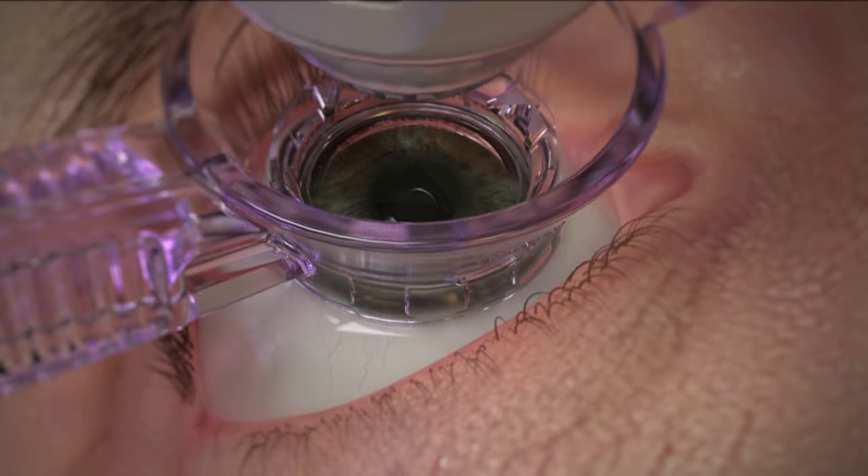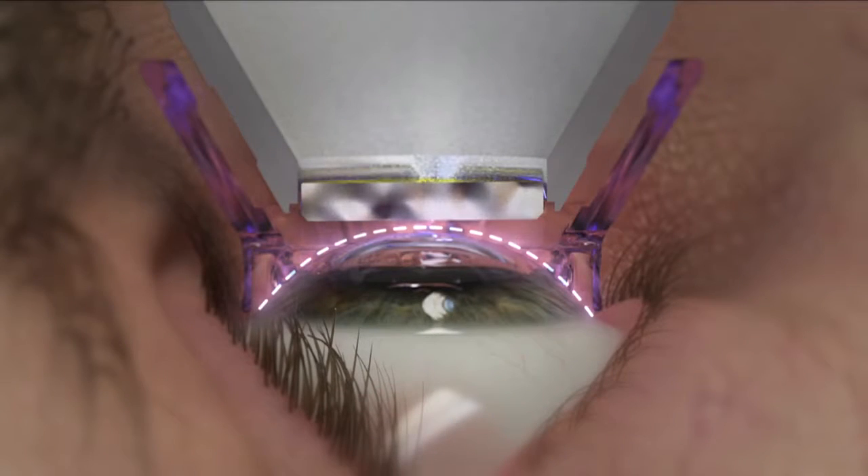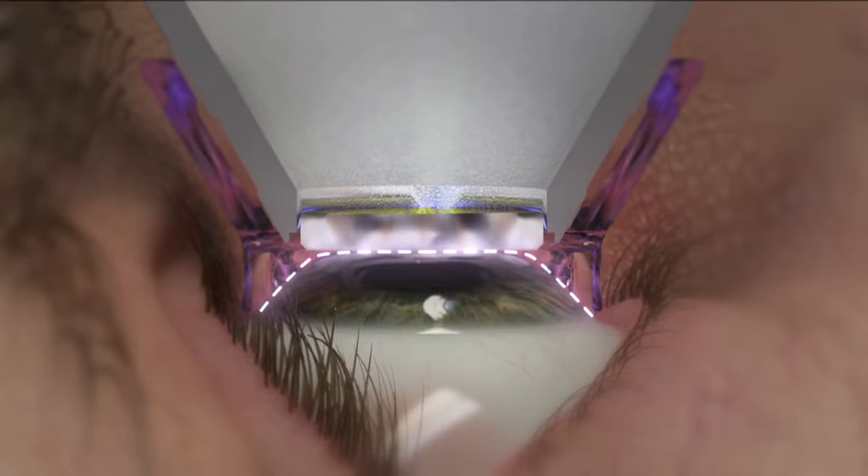Next, the applanation cone lowers down to dock with the suction ring. A second automated suction system engages, which secures the applanation cone within the suction ring while applanation occurs.